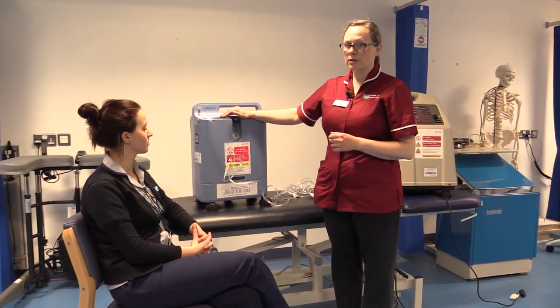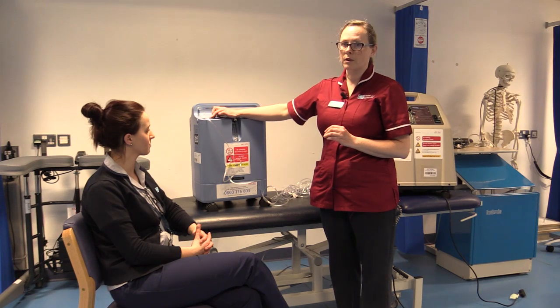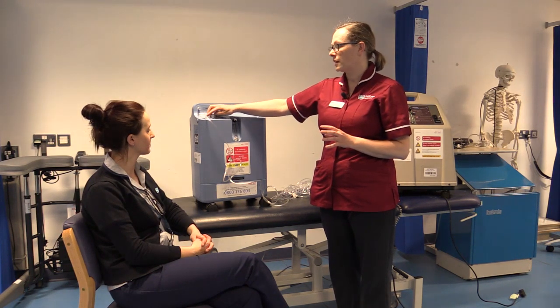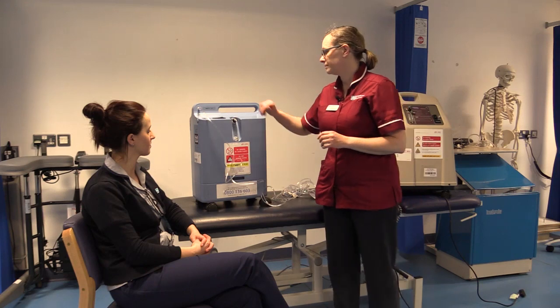The blue concentrator will be turned on at the wall. When we turn it on, you will hear a noise, an alarm, which will stop after a few seconds. And these lights will also light up, but they will also stop. If you turn it on and the alarm does not stop or the lights are on, you must phone the number on the bottom of the machine to report a fault.